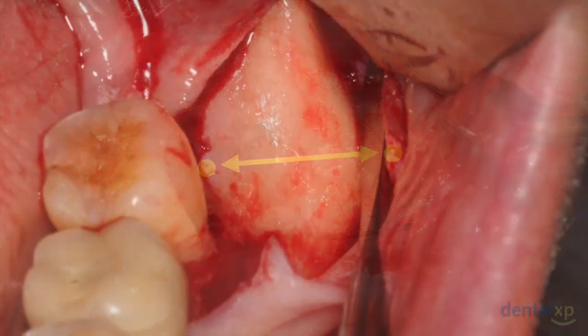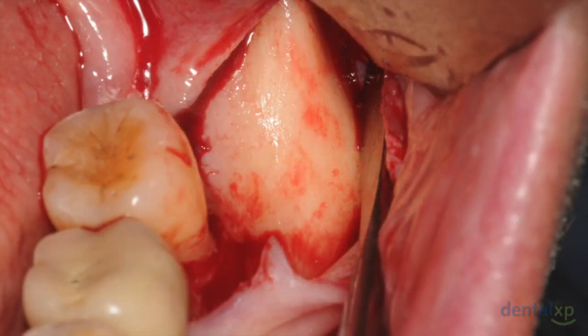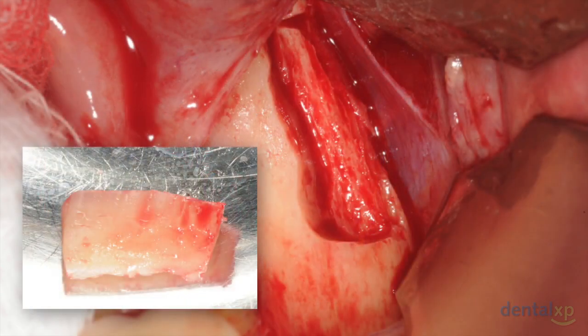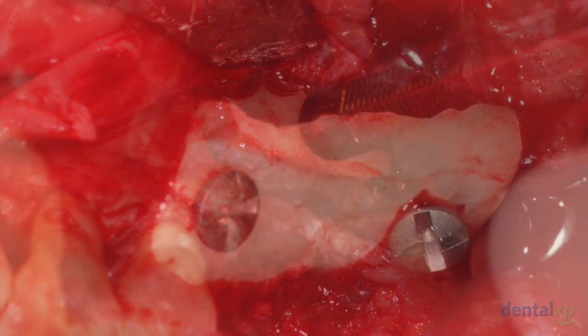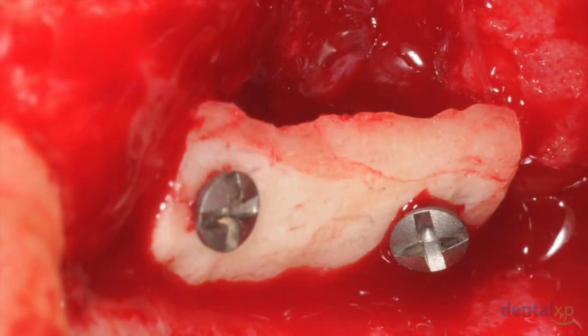We'll harvest the bone from the ramus, and since we only need a cortical shell, we can keep the width of the harvested bone to minimal. We'll then perform a sinus lift using a lateral window approach. The harvested cortical shell is then positioned directly on top of the ridge using the anterior ridge and the tuberosity part of the arch defect for a positive support, and then fixated with 2 screws.